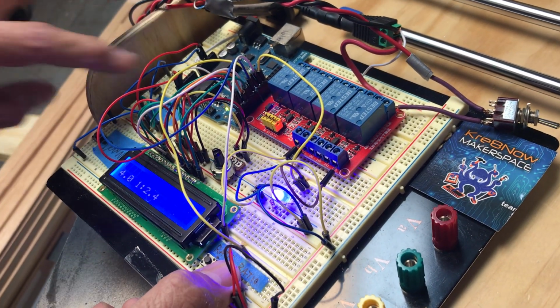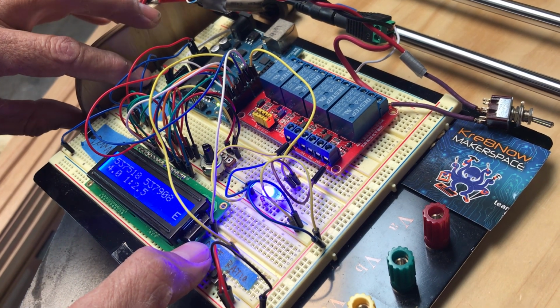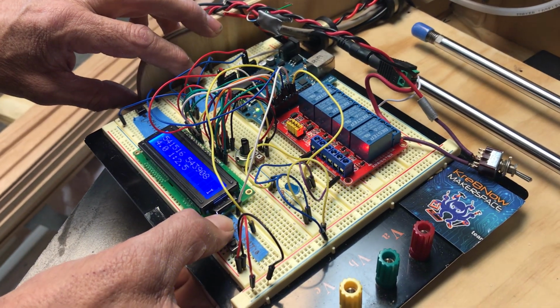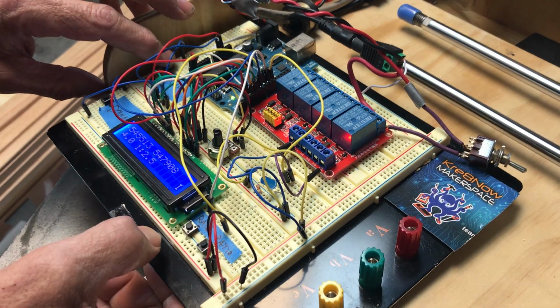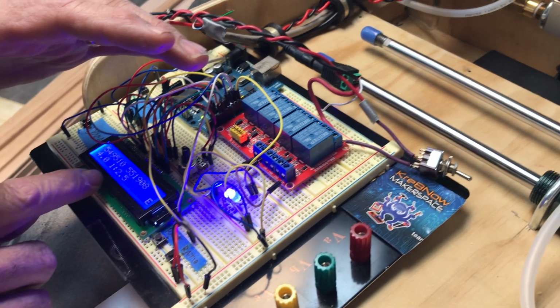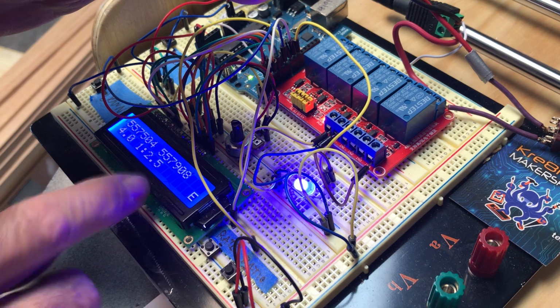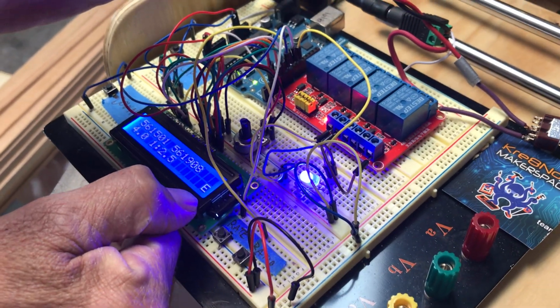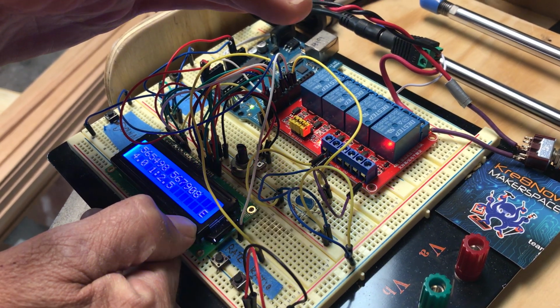You have to press the ratio and then the up or down button, and then you can press the rate or the up or down button. By using two hands, inadvertent changes of the baselines are at least reduced. We can see here we have 4 breaths per minute and a 1 to 2.5 inspiration to expiration ratio. We also have coded in here inspiration and expiration, which shows the status of the Arduino and what it's actually commanding the system to do at this time.